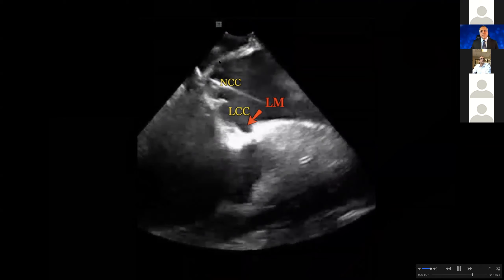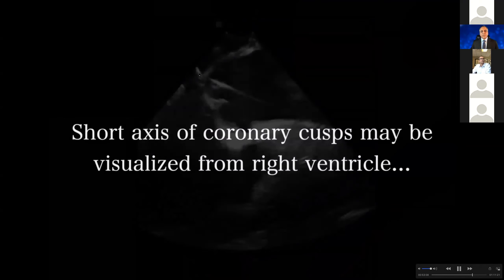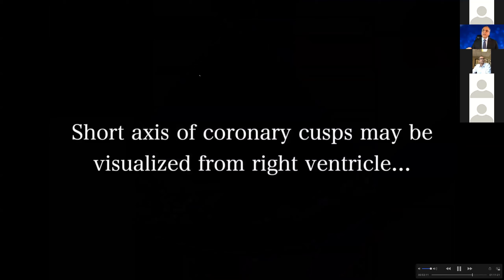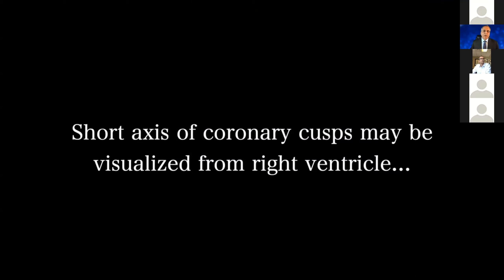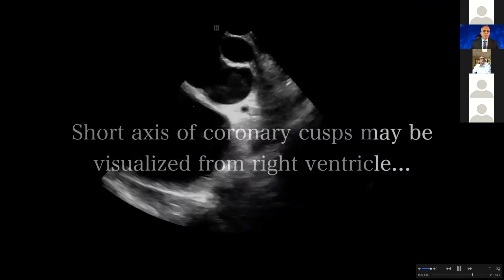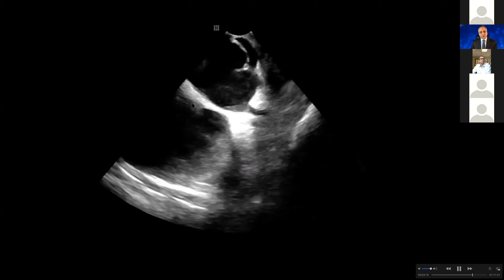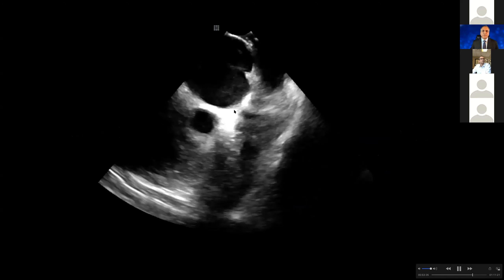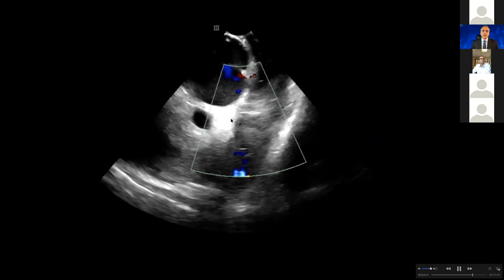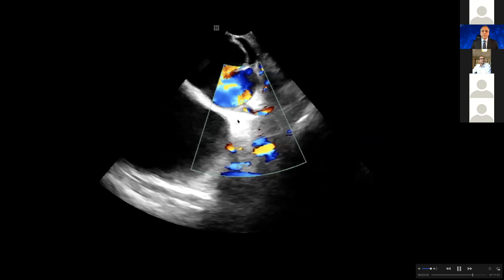Why? Because the septum is here, and the His is here. But if you counter-clock your ICE at that view, you're going to see the right coronary cusp. We had clocked it and we saw the left coronary cusp. You can also see that short view from the RV in short axis. You can see the left main here, and you can put the color Doppler to actually visualize the left main flow.